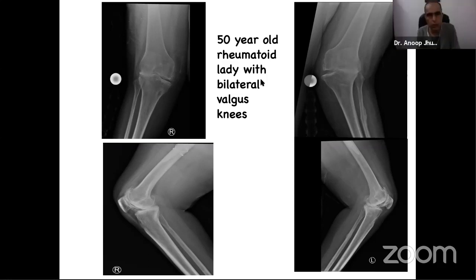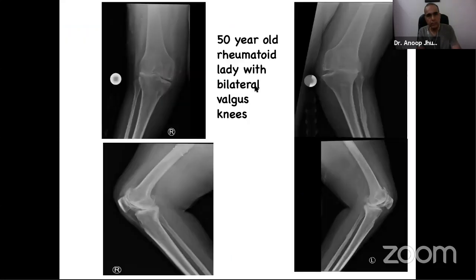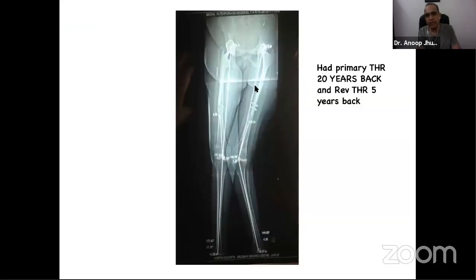Yeah. All right. So this is a 50-year-old rheumatoid lady with bilateral valgus knees, as you can see. And though both the knees look similar, this is the importance of taking long X-rays, and you can see something there. Though we take full-length X-rays in every case, I think for valgus knees and knees with extra-articular deformity, it's more pertinent. But I think it should be done in every case. Now, this lady is a rheumatoid lady, and we should see the hips and the ankle and feet in these patients.